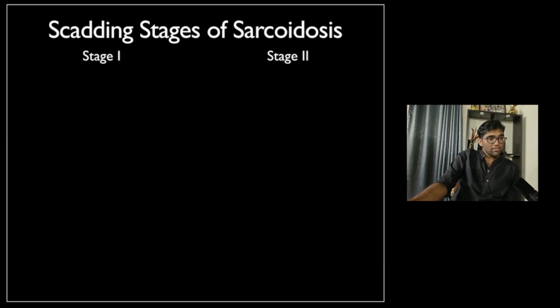When you talk about pulmonary involvement in sarcoidosis, Scadding stages need to be talked about, and these are described on chest imaging, basically chest radiographs.